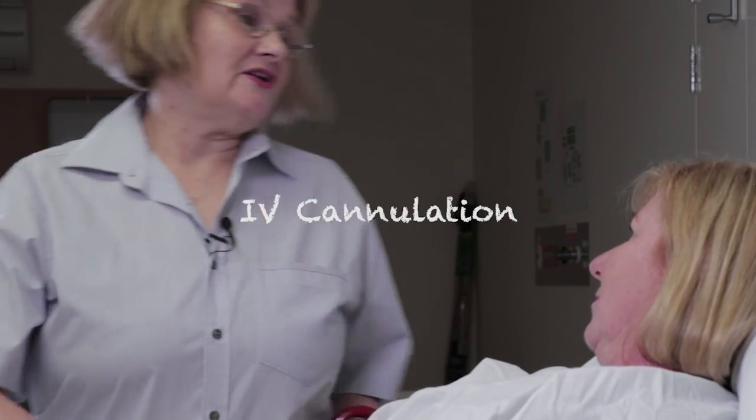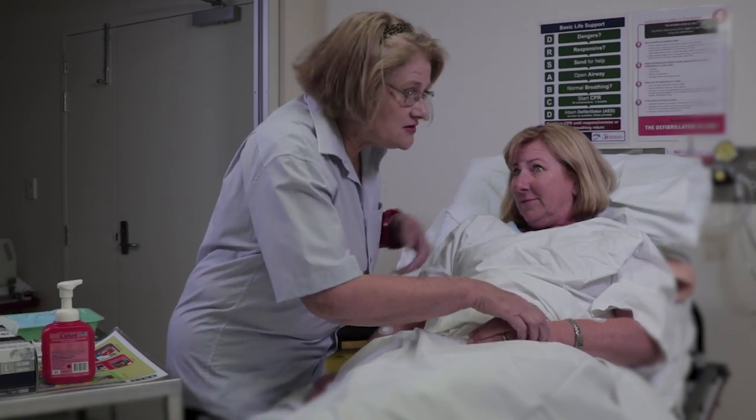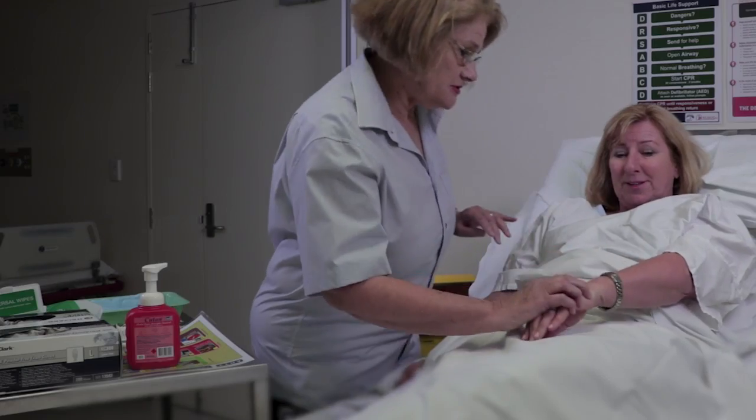Oh hello Mrs Thirst, I'm just going to have another go at putting that cannula in you — this IV, this cannula. Sorry about all that. I'm feeling like a bit of a pin cushion. Look, don't worry, I'm sure we'll get it this time, it'll be fine.